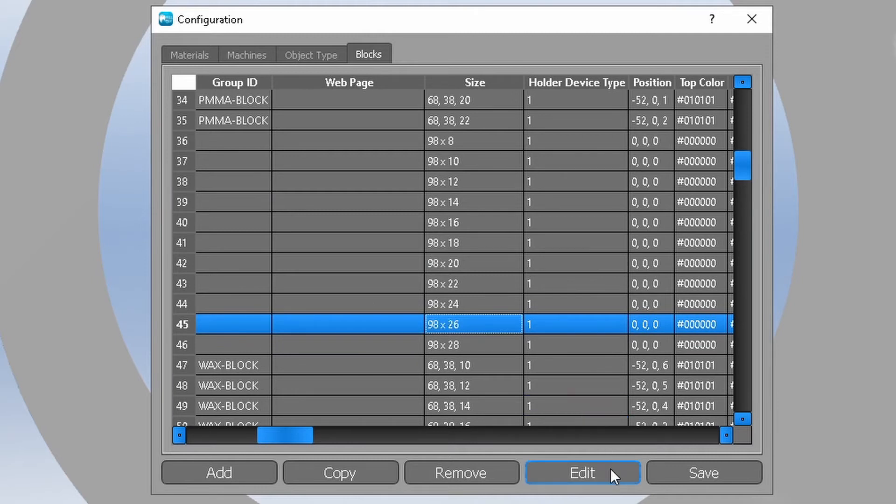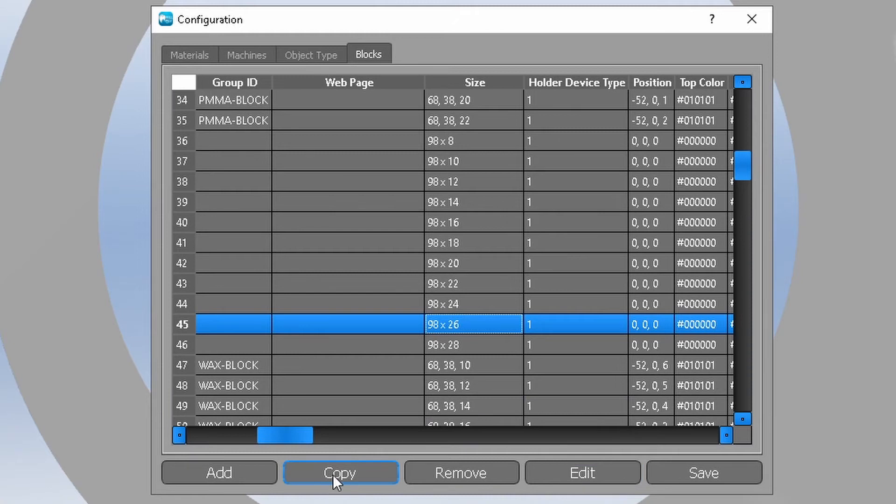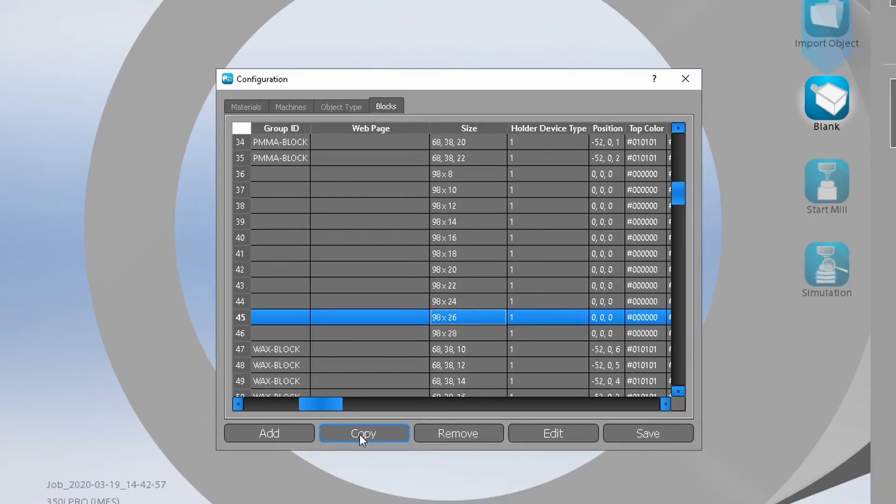Select the line and click edit button. If you want to add a new blank size instead of changing an existing one, then select a line with the closest blank thickness value and click copy button.